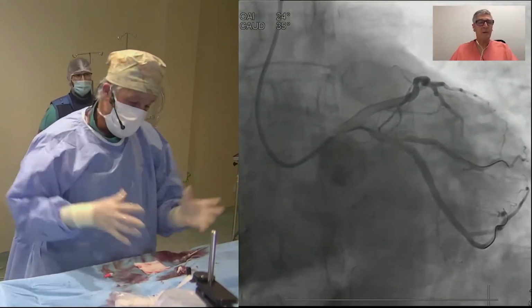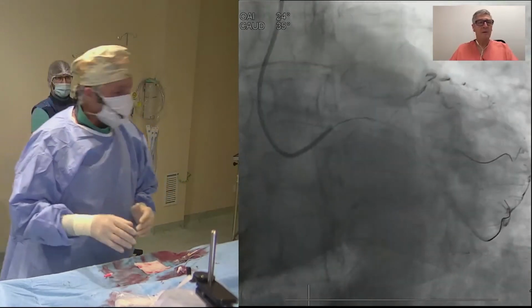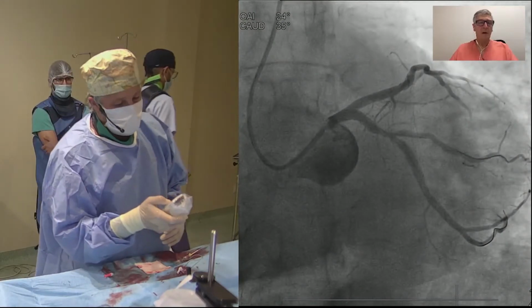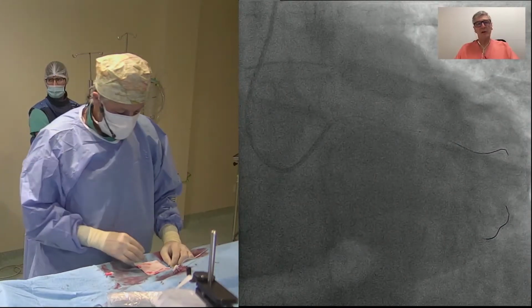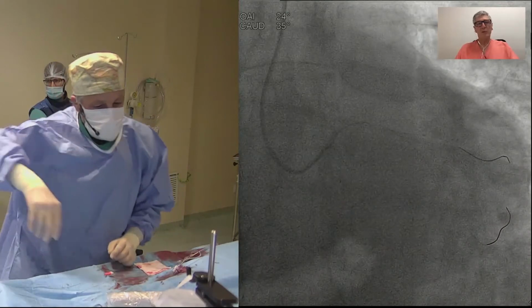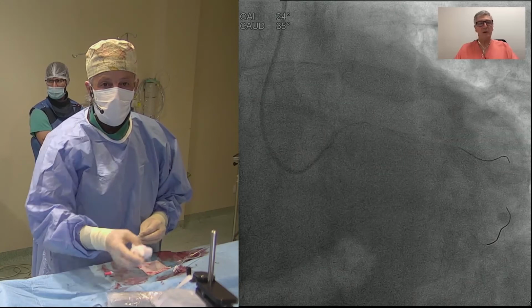Yeah. When you open the artery, you have more flow and more dilatation of the vessel because of the effect of the flow over the endothelium and all this. Think about the proximal optimization technique and have enough space proximal to the carina to be able to do proximal optimization technique according to the balloon that you have on your shelf.